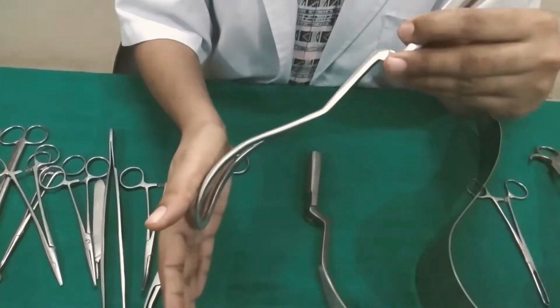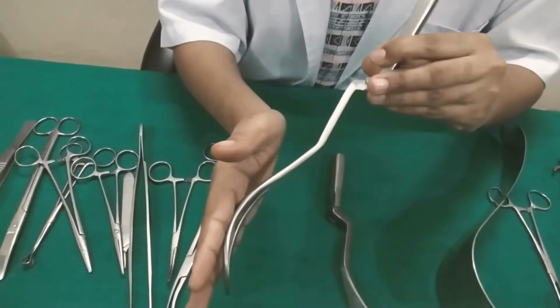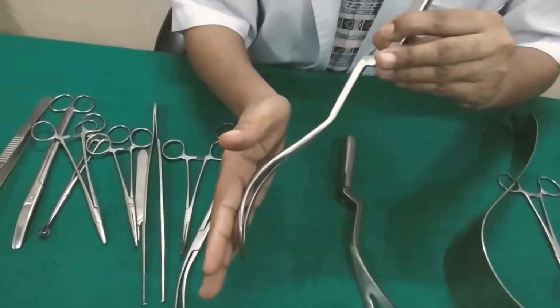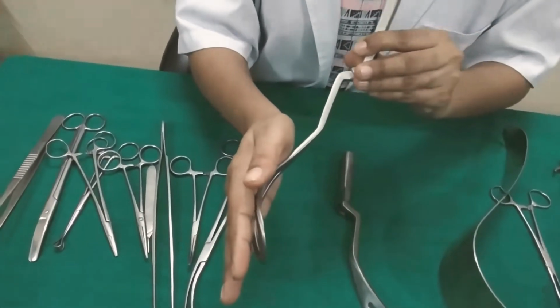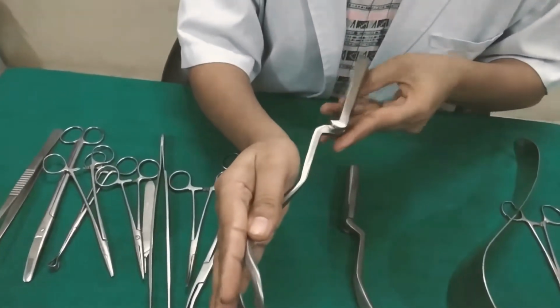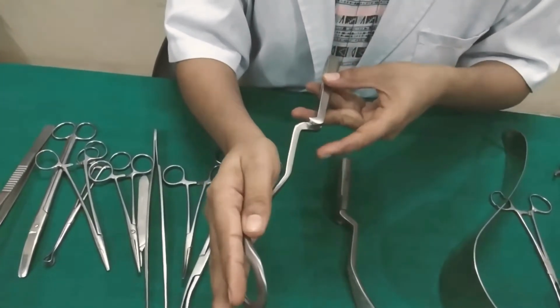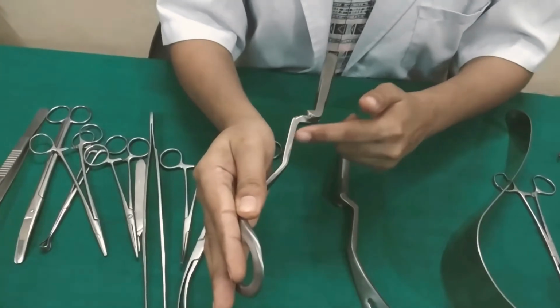Then the blade is introduced along the right hand, the blade is pushed up, and the handle is carried downward and backward, traversing a wide arc of a circle until the shank lies straight on the perineum.